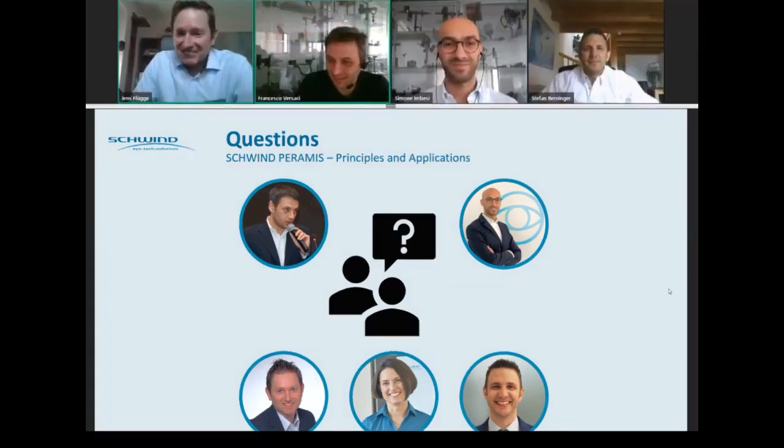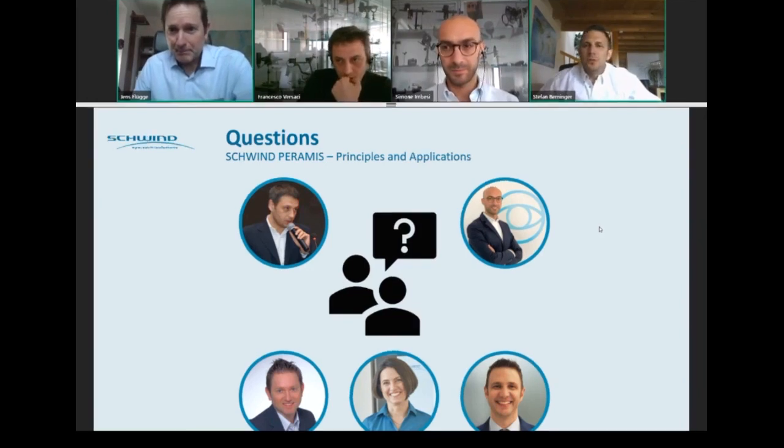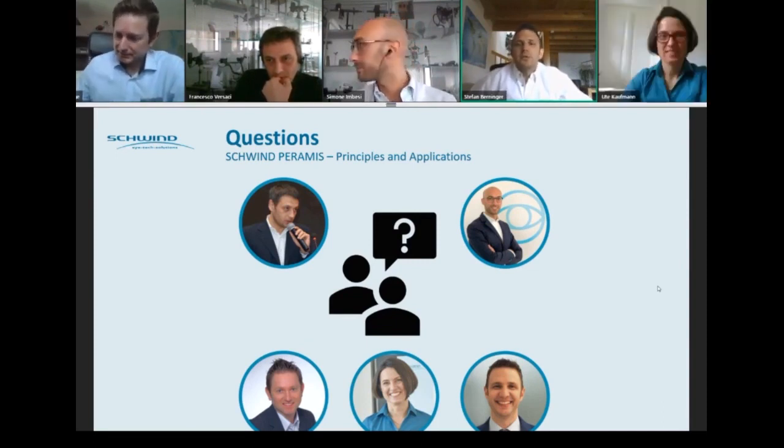I will now ask my colleagues Ute and Stefan, are there any questions in the chat? Yes, there's one question. So the question is: is it possible to measure or to detect a tilt of an IOL?